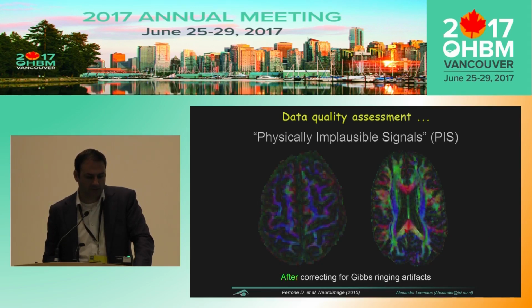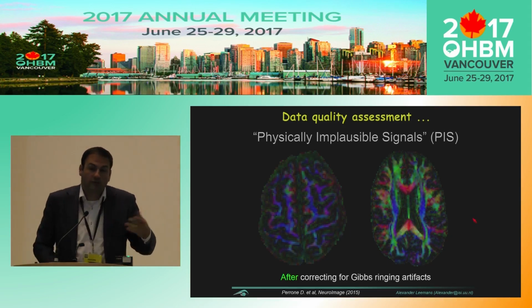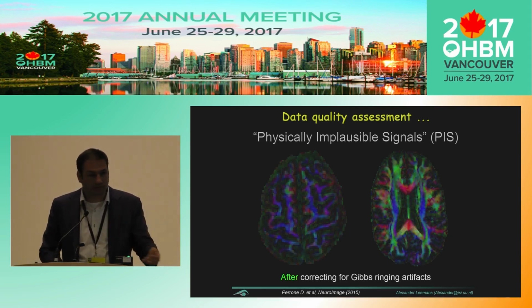Okay, and also notice that the sharp transitions, the edges, they're not blurred out. So you could have used an isotropic Gaussian smoothing approach. It's also quite common, but that obviously has a disadvantage to blur out your edge information.